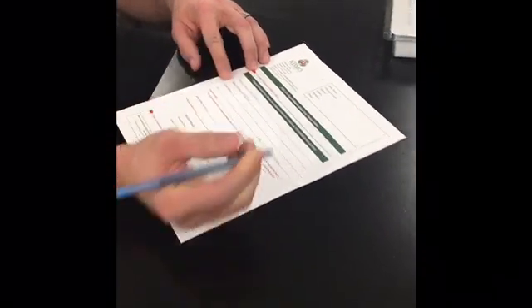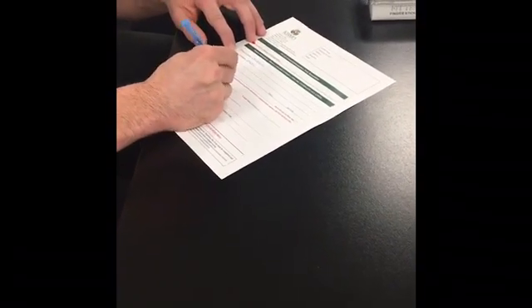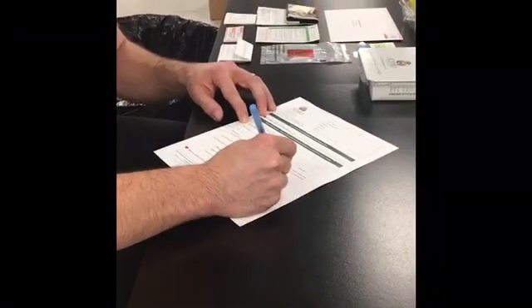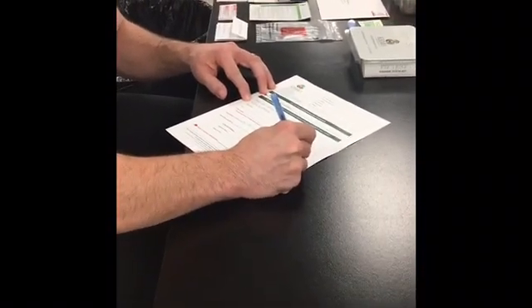Next, complete the patient requisition form. Be sure to include the patient's first and last name, the patient's date of birth, and the sample collection date. Please also include your signature at the bottom of the form.